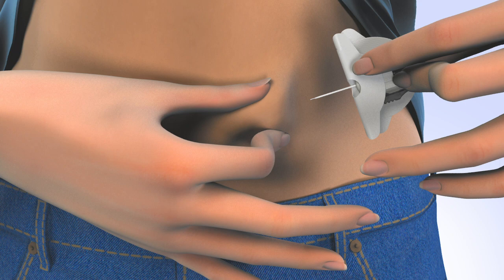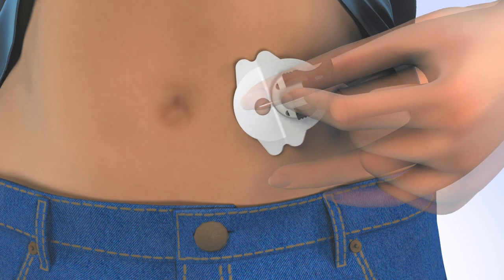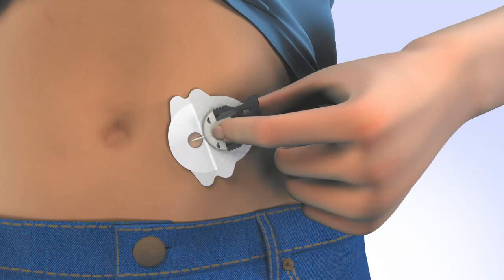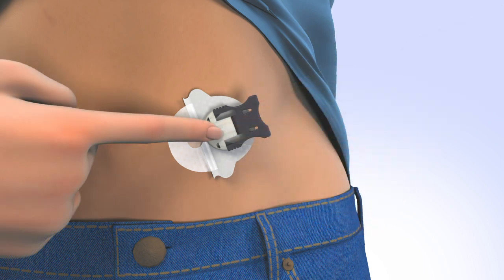Position the infusion set needle at a 20 to 45 degree angle, or as instructed by your trainer, and insert. Release the hand that is pinching the skin, continuing to hold the infusion set next to the skin. Holding the cannula housing with one hand, remove the front paper backing and smooth the adhesive securely to the skin. Place a finger on the front portion of the cannula housing.